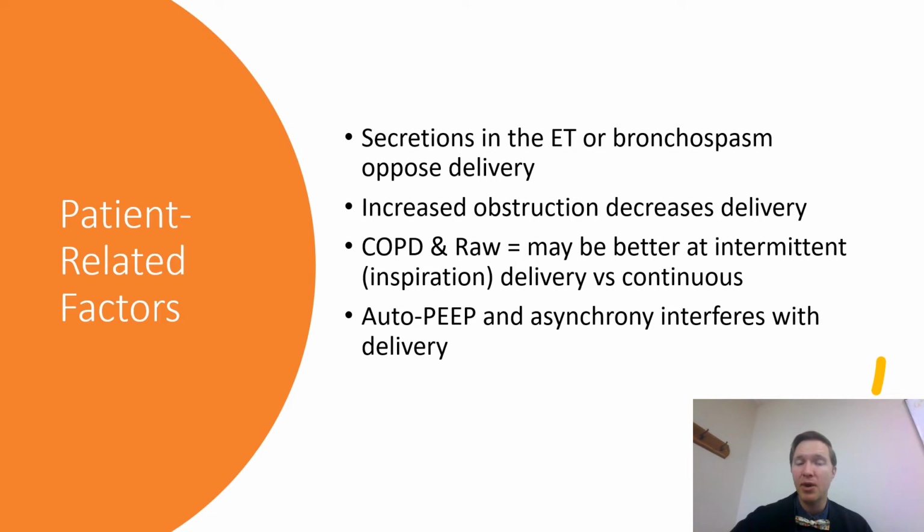Some of these ventilator modes, some of these nebulizer modes, have what's called an intermittent option, where it only nebulizes during inspiration. I remember the 7200 from, now they're called Medtronic, but they were called Puritan Bennett way back. There was an old ventilator called the 7200. If you want to go Google image that, have fun. That sucker would nebulize on inspiration, inspiration, inspiration. So it would be an intermittent mode, right, on inspiration.